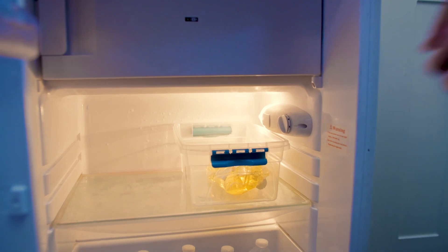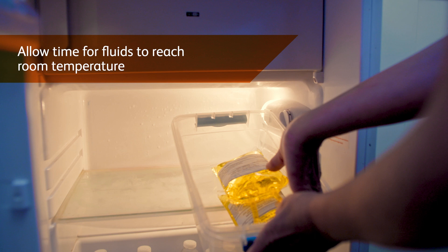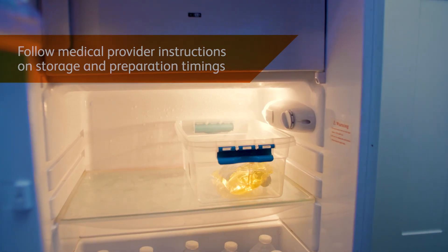You may need to store infusion liquids in the fridge. Remove fluids to allow time to reach room temperature before preparing to start an infusion. All supplies, infusion sets and preparation instructions will be supplied by your medical provider.